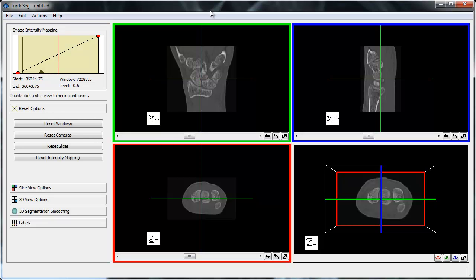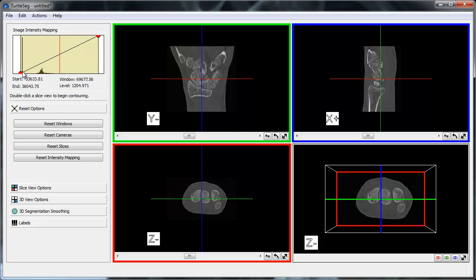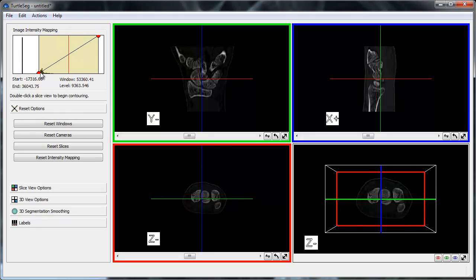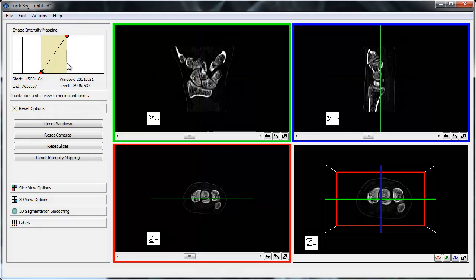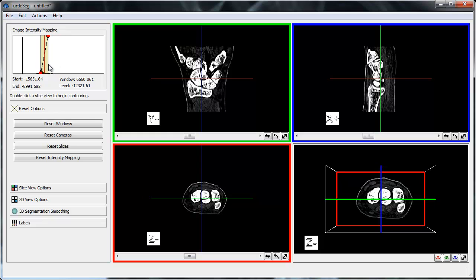To begin, we'll adjust the window level of the image so that bones have a high contrast. This can be done by left-clicking and dragging the intensity start and end ranges in the sidebar. This should do.